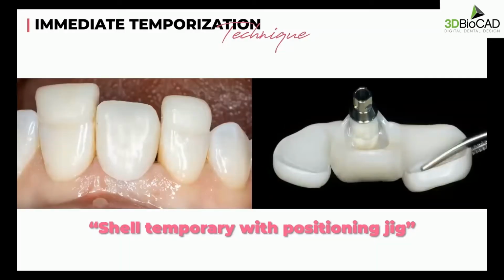So using natural teeth as a temporary is a really good technique. You can get a very good result, but obviously you can't use that technique for all cases because sometimes the existing tooth will have large decay or a lot of restorations on it. So it's not a technique that you can use all the time. So I'll go over a technique that I use for most of my immediate temporization cases.